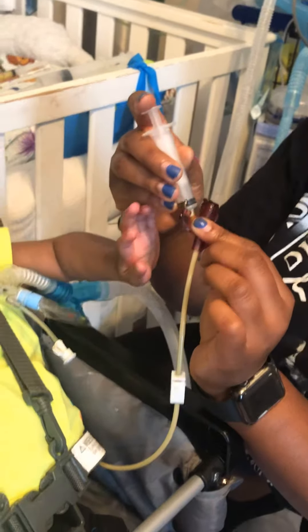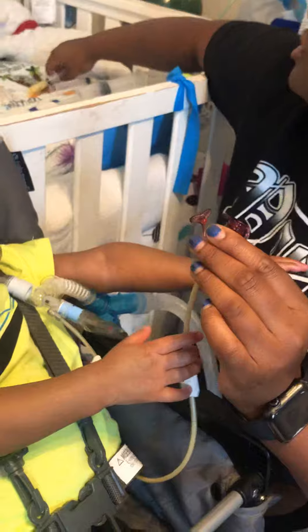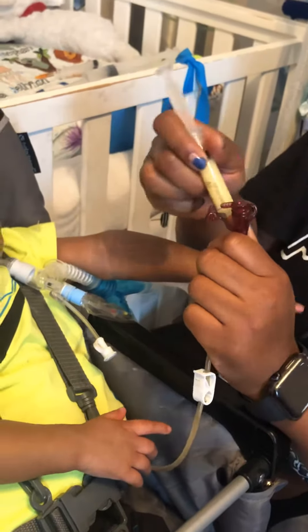Open the clasp and slowly push the meds in, then close the clasp. You do that same routine until you have given him all of his meds.